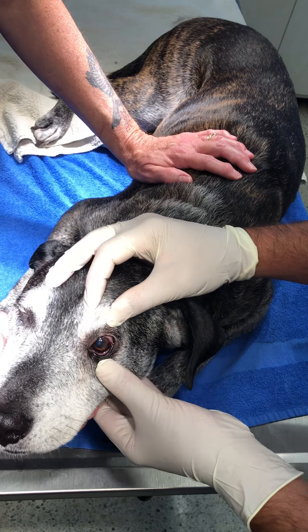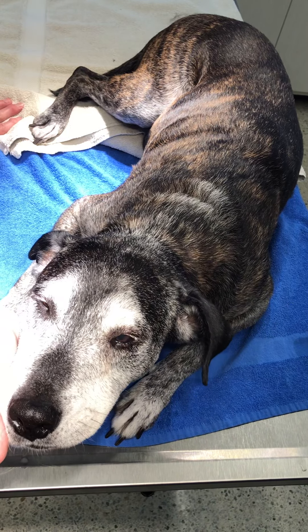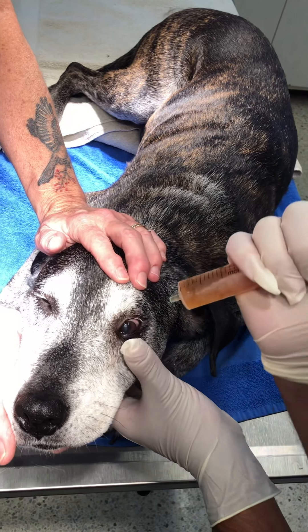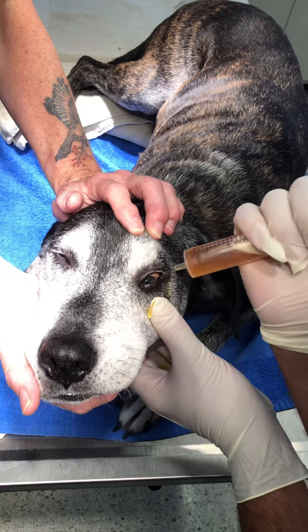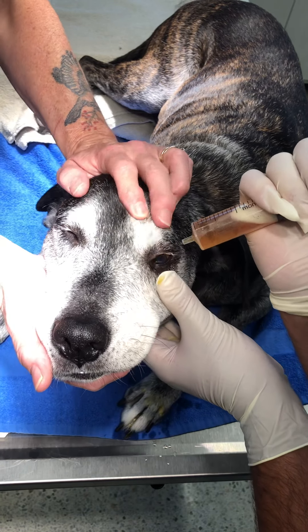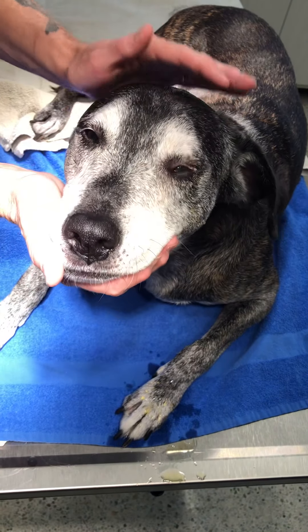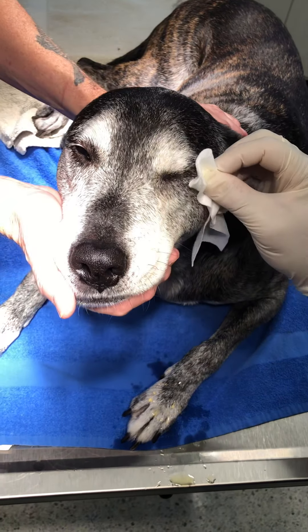The lesion is located ventral and lateral to the pupil. It's a small lesion — it was previously stain positive, and on recheck it's still having a diffuse edge and still stains. We're now flushing the eye. She has been previously on antibiotics, and it's ideal that they are on antibiotics before we perform this procedure.